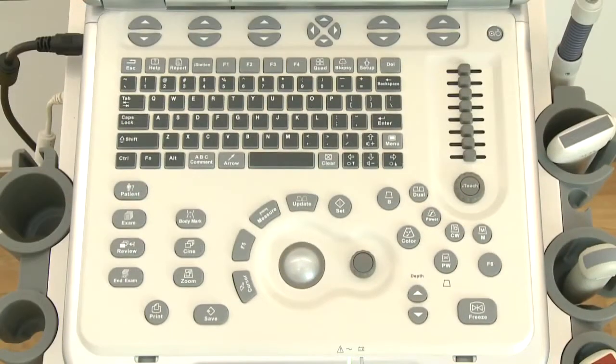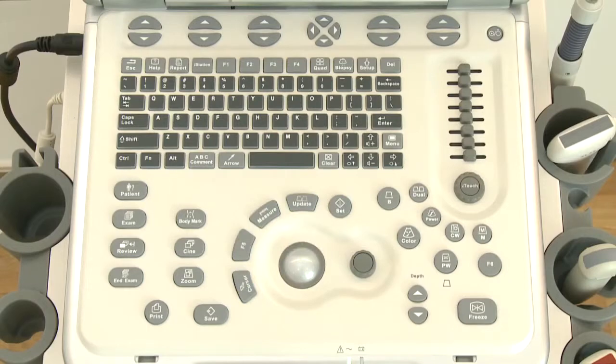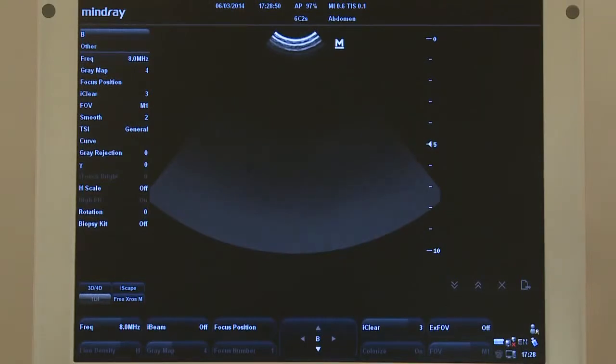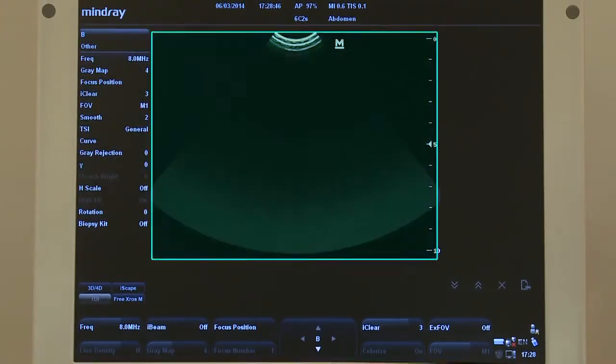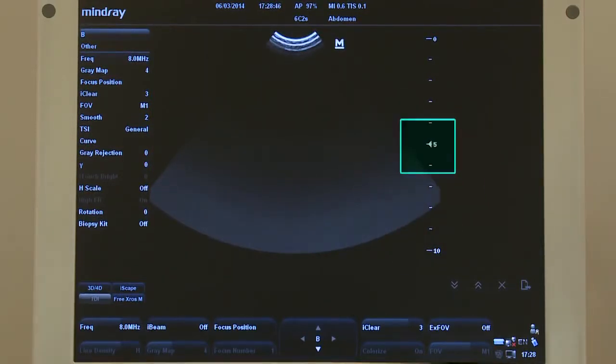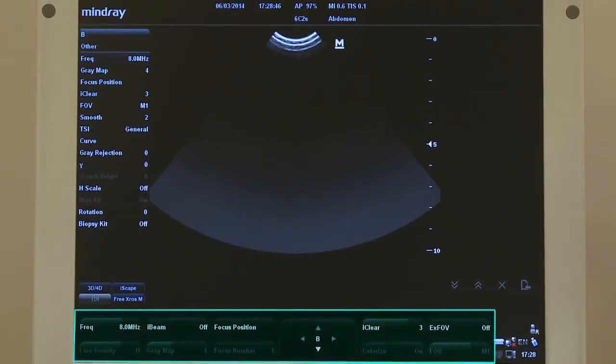The control panel is divided into several sections: keyboard, parameter, function control, body mark, and comment sections. The screen is also divided into different sections: menu, image display area, coordinate axis, focus position, probe indicator M, and image parameter.